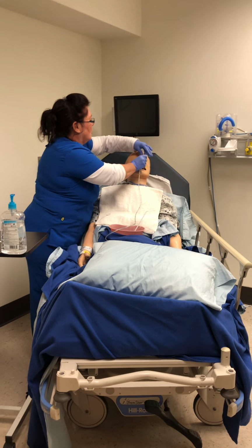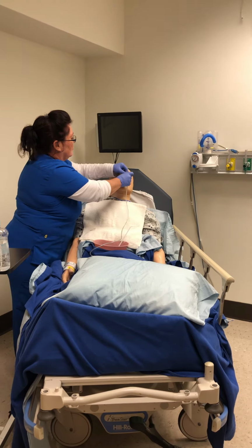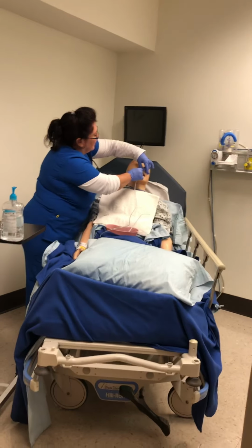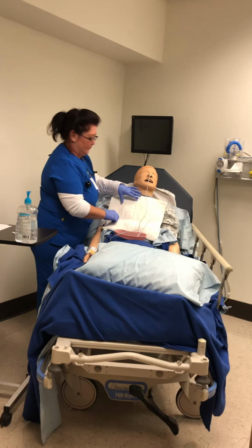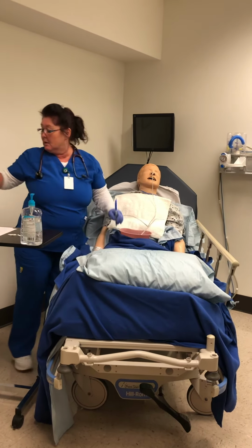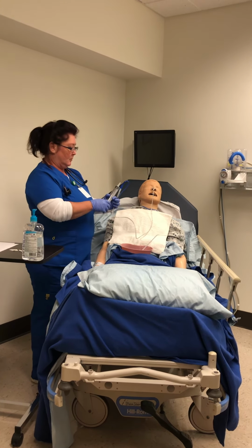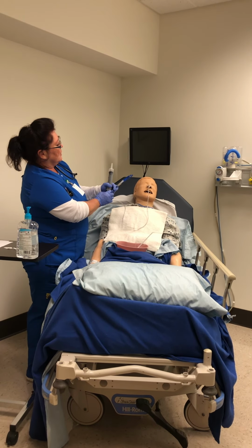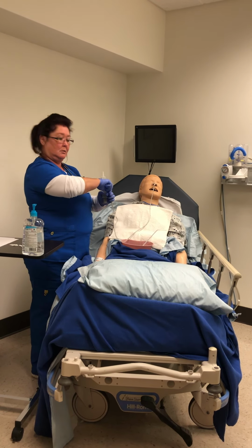Okay, we're going to attach the tube. Making sure that the tube is not resting on the top of the nare because we do not want to get skin breakdown or sores. And then I am going to get my syringe. I'm going to pull it back 10 milliliters for air, just in case when I unplug this that the gastric juices are ready to go.